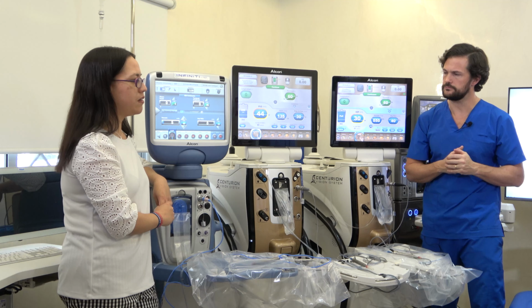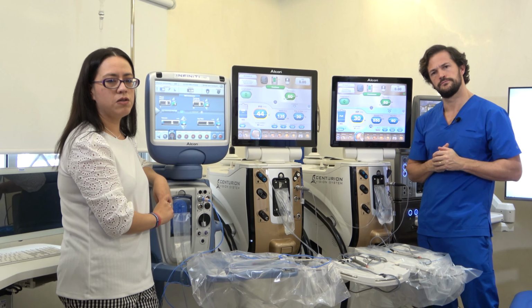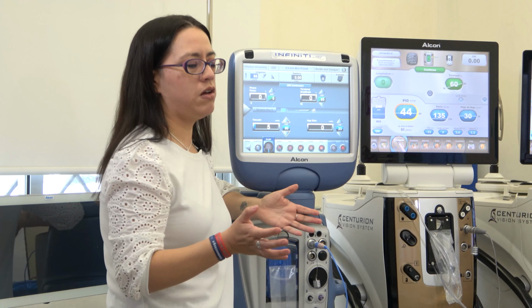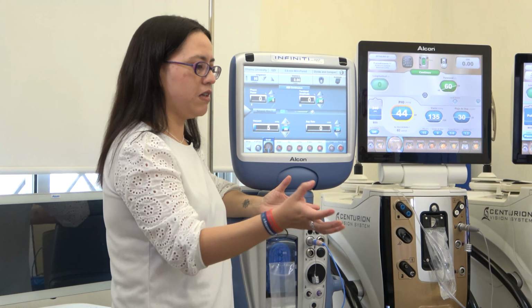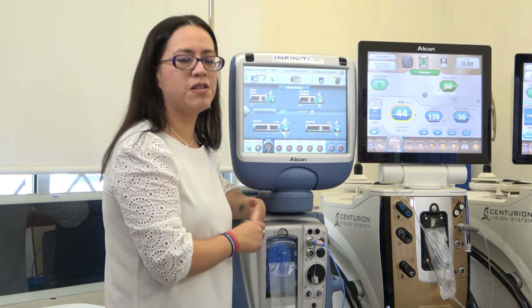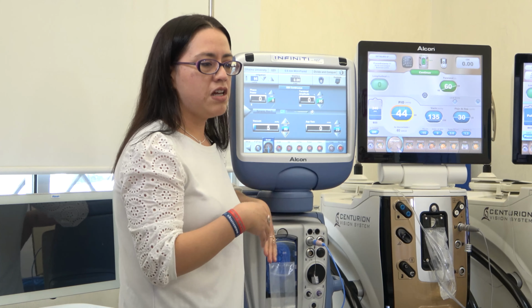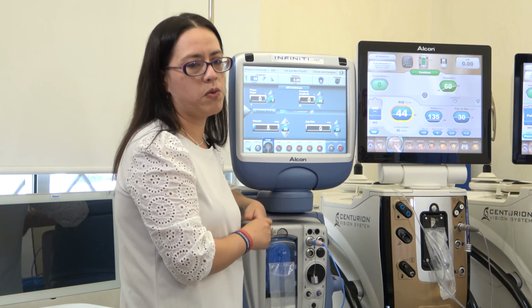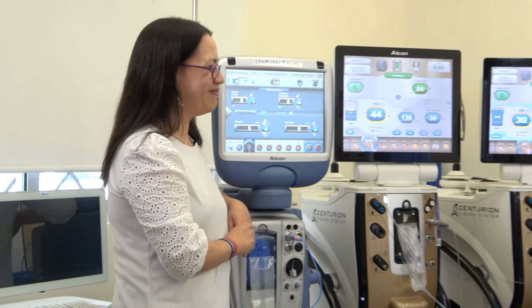Right, because the continuous also is not in need of having the fluidics help you bring the fragment back. So that's why we sometimes recommend using the Ozil continuous, so that you don't have repulsion and you have the flowability that you need. But it's up to you.